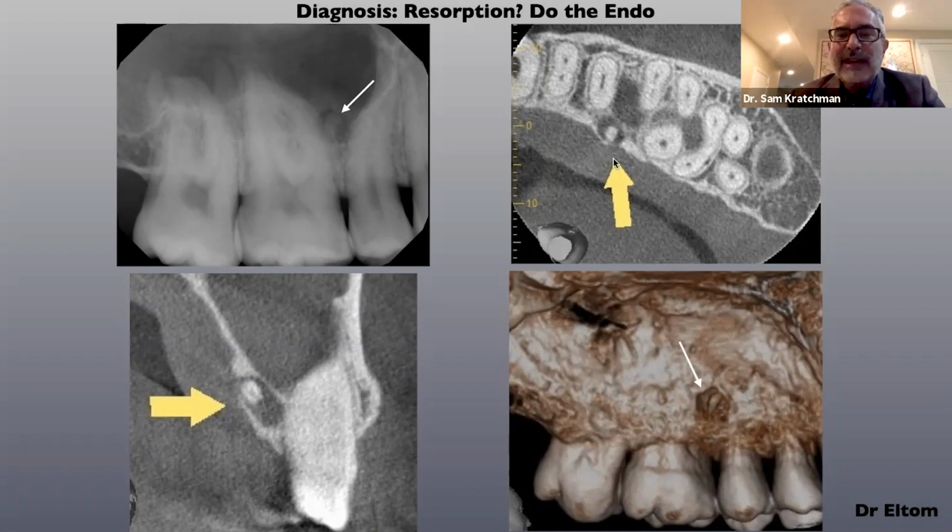So what we're looking at here on the axial view is the palatal aspect, and we're looking at an area between tooth number 4 and number 3. So here's tooth number 3, mesial, distal, palatal, tooth number 4. Here, this would be considered the sinuses at this level. And here is a retained root tip, if you would. And you can see it's all the way palatally, almost perforating out through the palatal bone area.